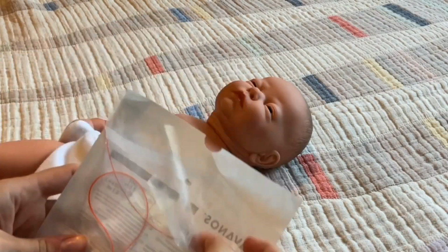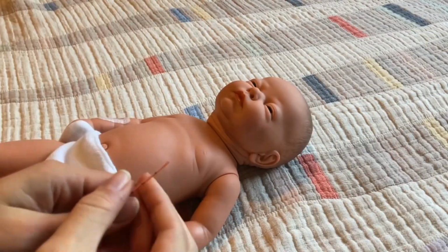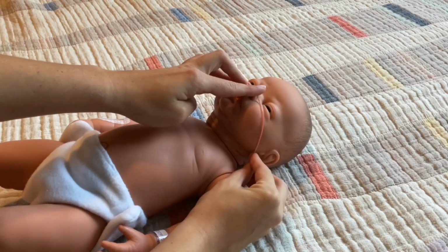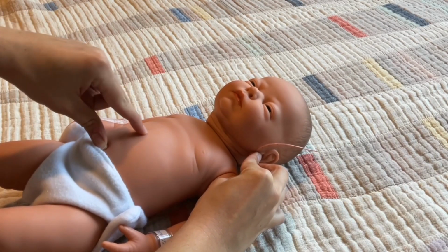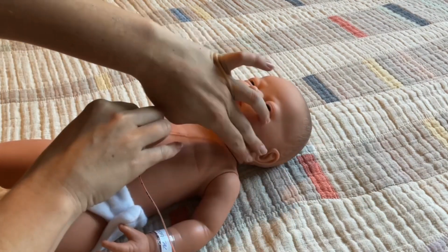Take your NG tube and we're going to measure the length we need to insert. You're going to start at the tip of the nose, down to the earlobe. Then you want to find the halfway point between the end of the breastbone and the belly button. So about right there. Then measure the length of the tube to that point.